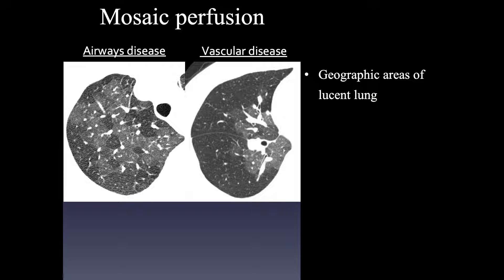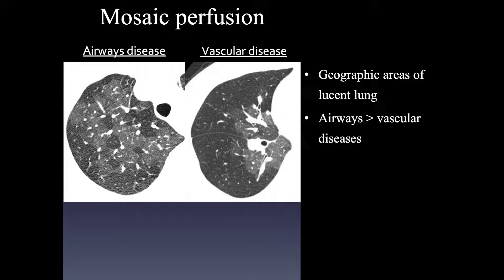There is some controversy in the use of the term mosaic perfusion. We use this term at UCSF and it represents geographic areas of lucent lung. This is most commonly seen with airways disease, less commonly with vascular diseases. What it does represent is decreased perfusion regardless of etiology.